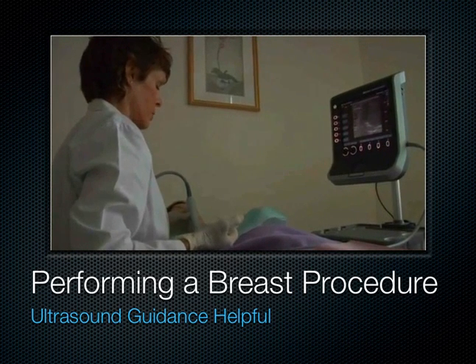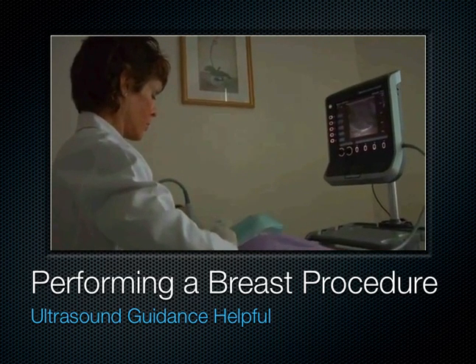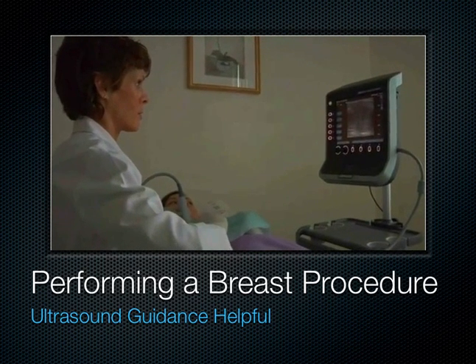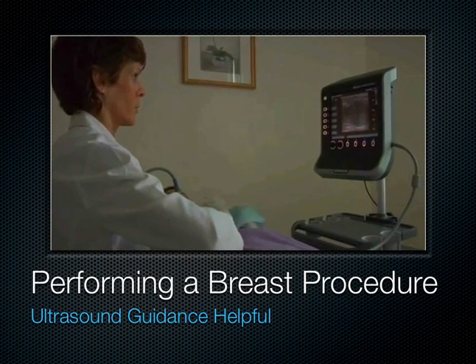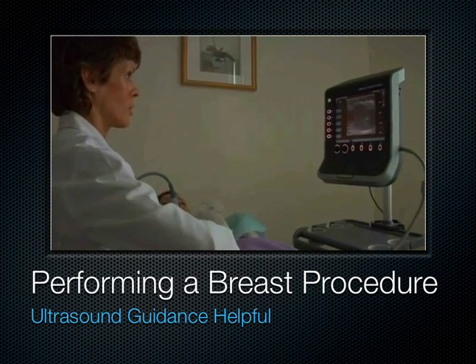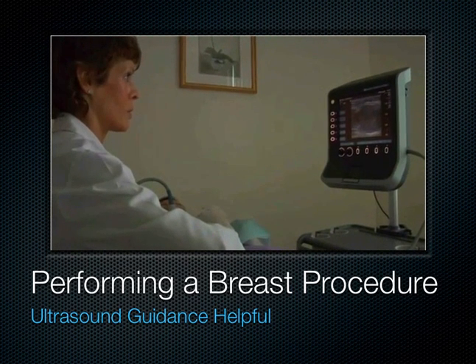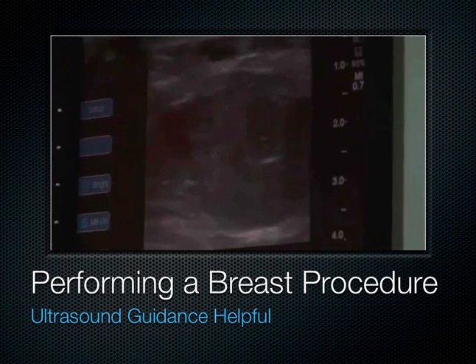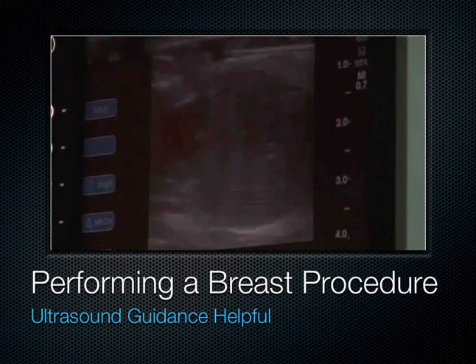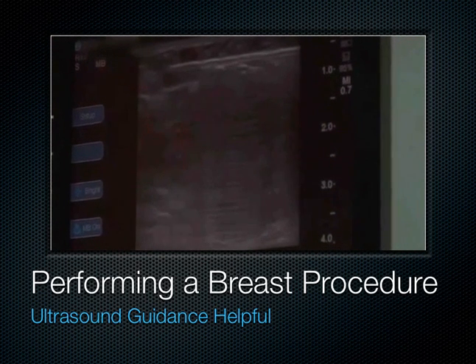And then I'm going to put some up over the top, which does two things. One is it gives us some numbing up top, but the other is, see how close this fibroadenoma is to her skin. Once we start the freezing, we need to protect that skin, otherwise she's going to get frostbite, and then it sort of defeats the purpose of a nice cosmetic procedure. So in putting some numbing up here, it gives her the anesthetic effect, but it also drops that fibroadenoma down and gives us a little room for that ice to do its job.